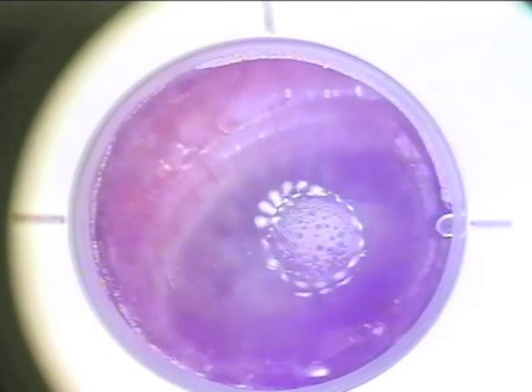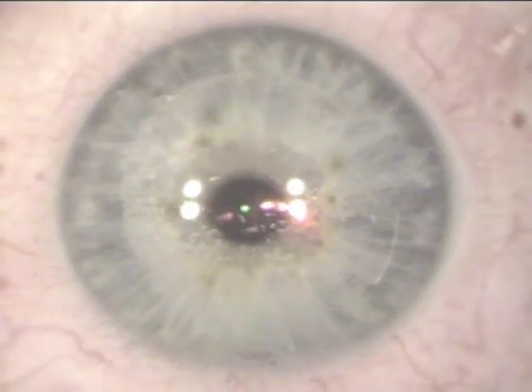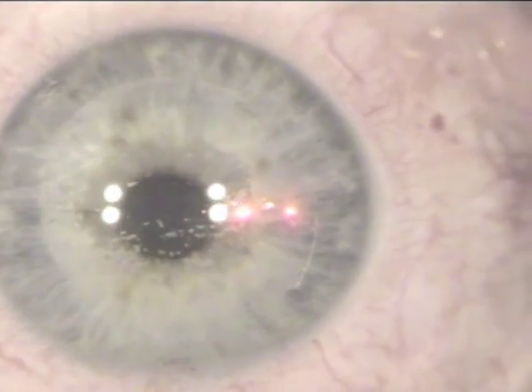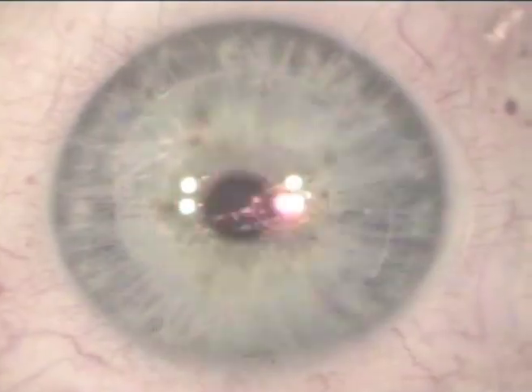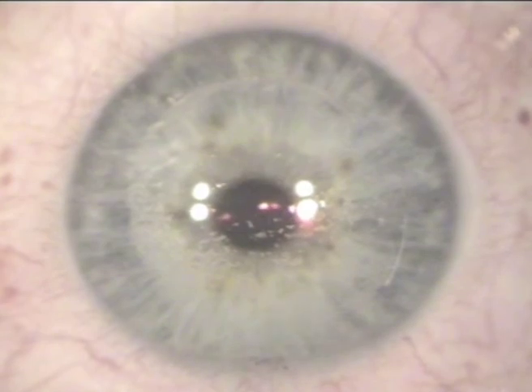And please note the 8.5 millimeter flap in conjunction to the rest of the cornea, showing you how large an area is being applanated, a clear advantage in hyperopic cases. We're going directly into the excimer laser now. You can see the aiming beams, the red aiming beams. This is unedited as far as the femtosecond and excimer laser procedures.